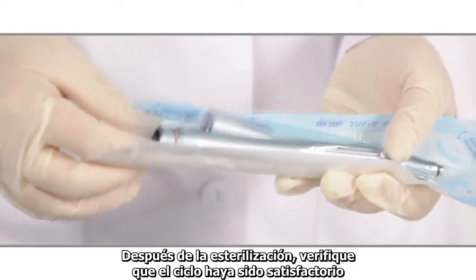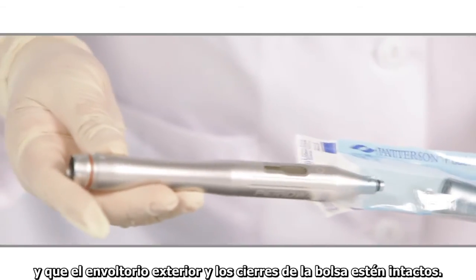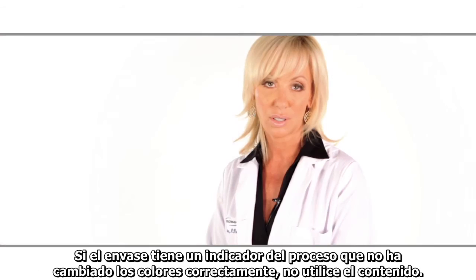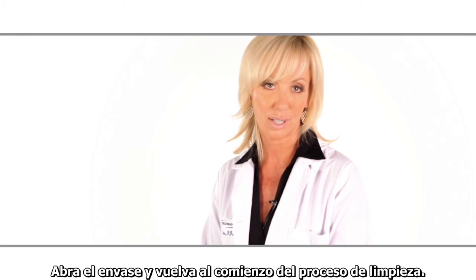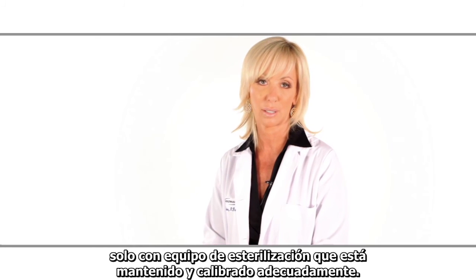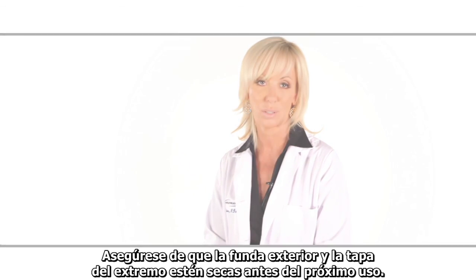After sterilization, check that the cycle was satisfactory and the outer wrapping and seals of the pouch are intact. If the pack has a process indicator that has not changed colors correctly, do not use the contents — open the pack and return to the start of the cleaning process. The recommended sterilization procedures are valid only with sterilization equipment that is properly maintained and calibrated. Ensure the outer sheath and end cap are dry prior to the next use.